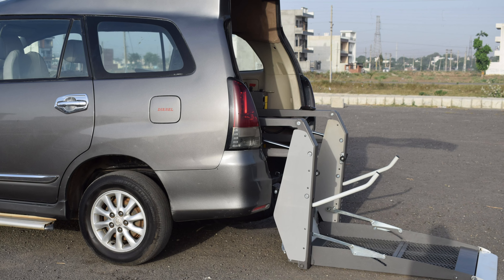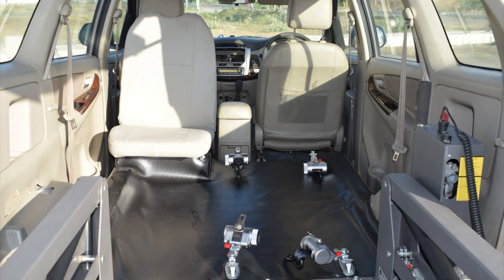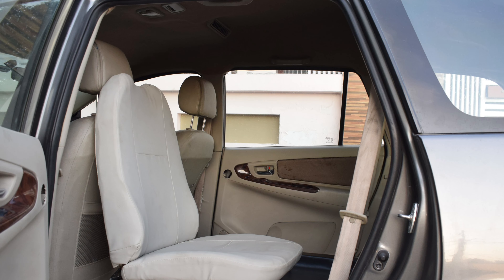Now let's go inside and see what else is there for us. On our customers' demand we have also provided a side seat for an attendant or anyone who would like to sit with the wheelchair user.